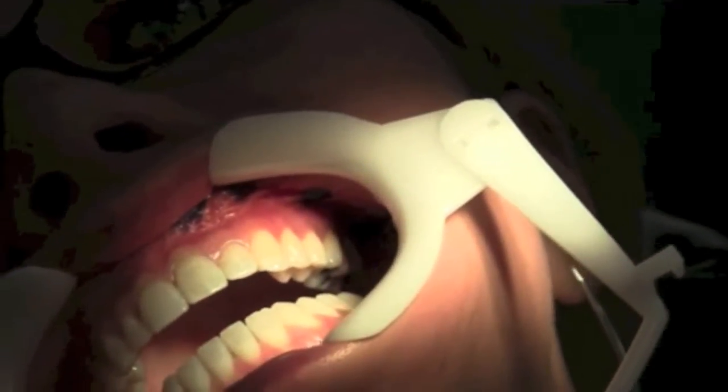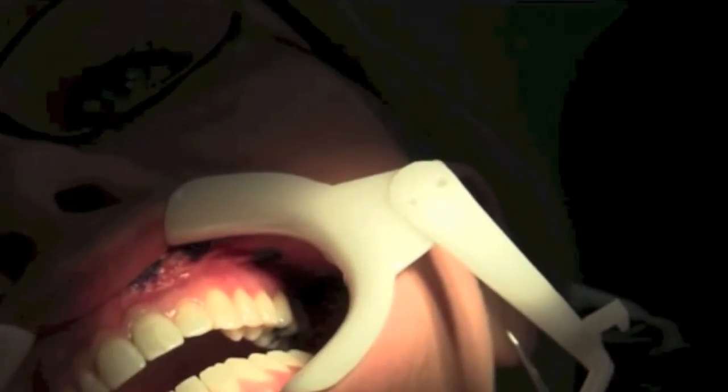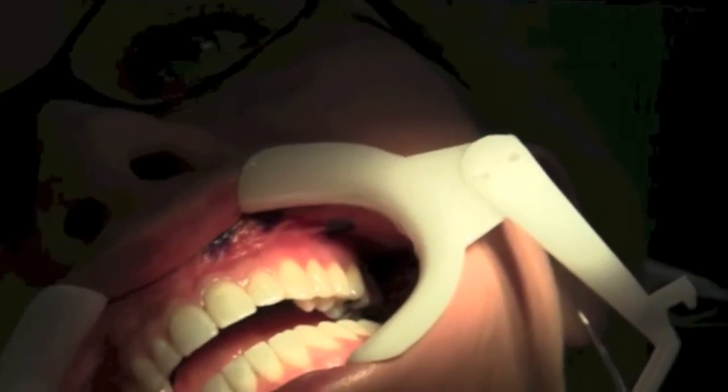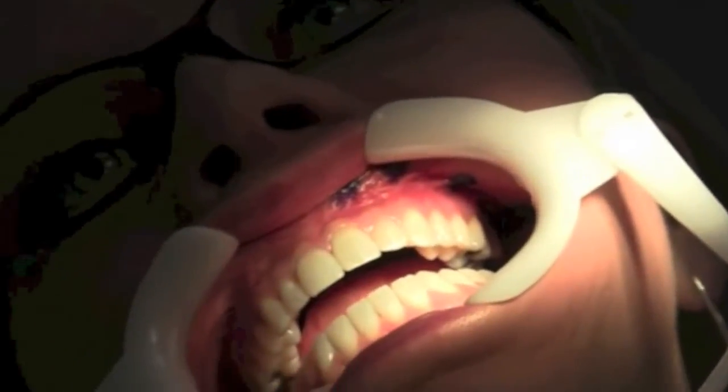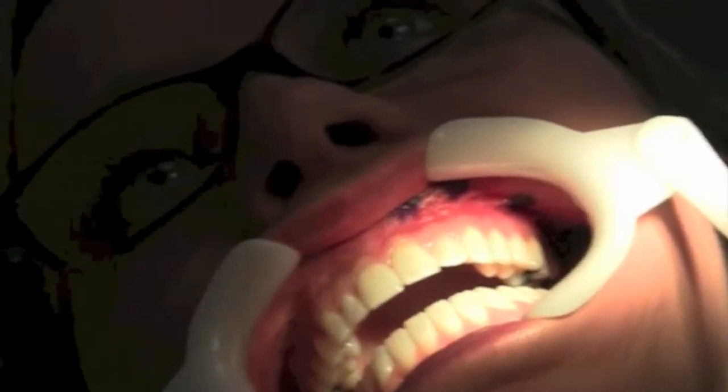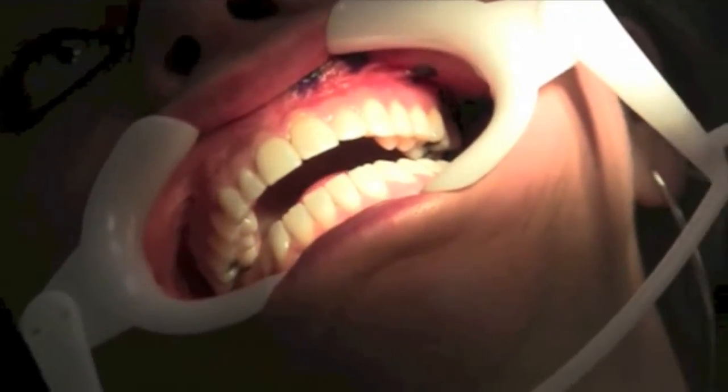The next nerve we're going to talk about is the nasopalatine nerve. The landmark is next to the incisive papilla. It affects palatal tissue lingual to the maxillary anterior teeth, 1-3 to 2-3. A short needle is used. It is the only nerve that crosses the midline.